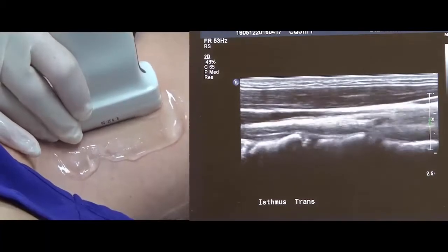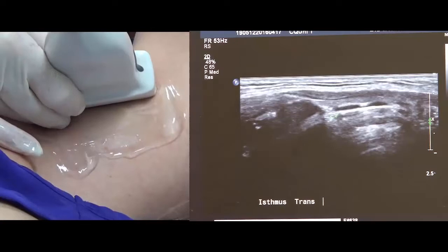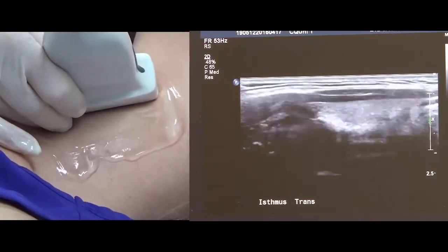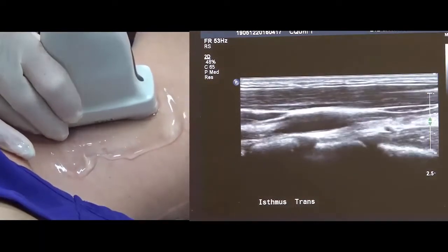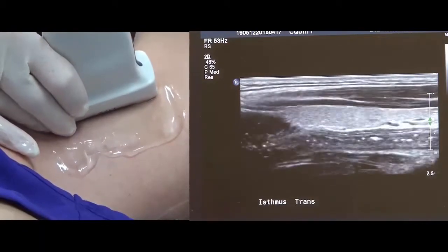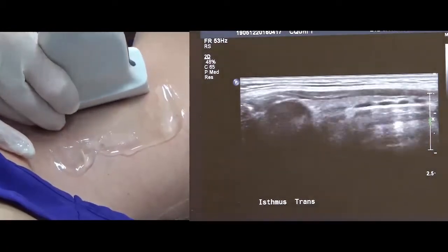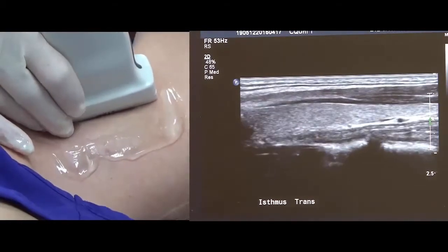We don't need to go any further to the jugular. Coming back through medially, through the rings of the trachea, we can see here, which shows us the isthmus. So that's our contour. Then let's have a look at our content. All the way laterally, coming back in medially. There's those rings. So now I feel like I've assessed that gland thoroughly.